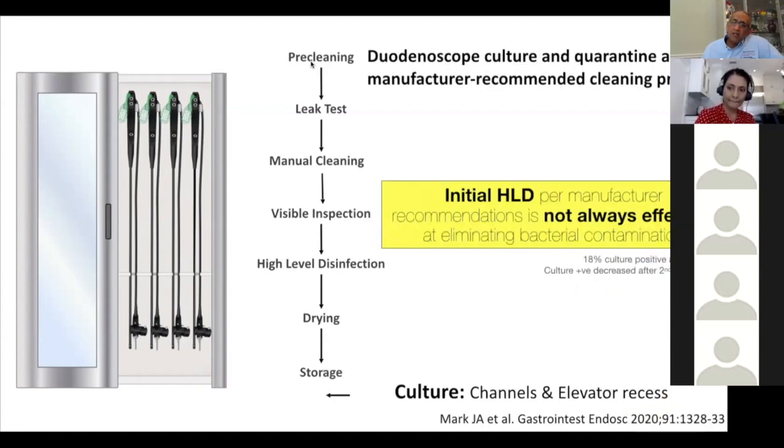There's another study that's also very interesting. That also came in GIE in 2020. This study came from the US. They followed manufacturers' recommendations, MFI, the manufacturer's instructions.